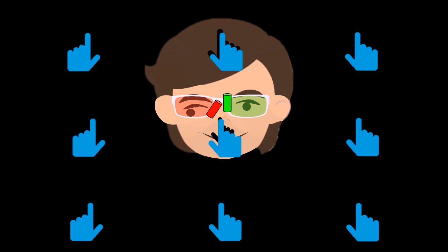So far, I have illustrated the bar spatial misalignment in primary position, but this misalignment may also be present at all gaze positions. To emphasize this point, in the next few frames, we will see a patient with right superior oblique weakness and the corresponding bar diplopia chart. In this frame, you can see hyperdeviation of the right eye in primary position, maximal on levo depression, present in levoversion, and to a minor degree in depression, dextrodepression, and dextroversion, but not present in up gaze.